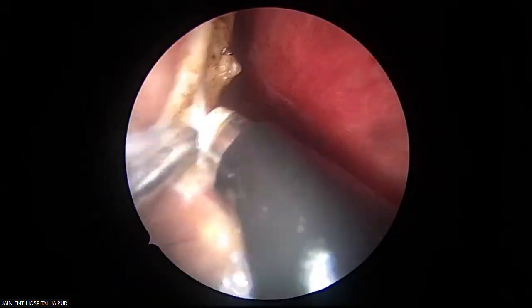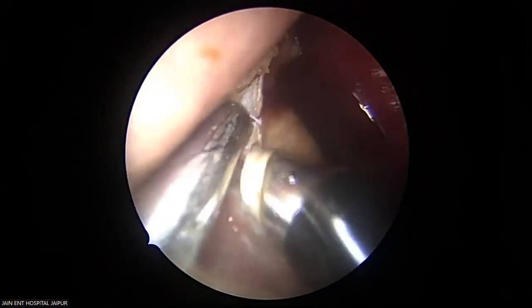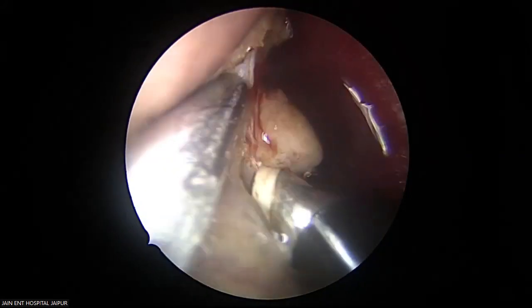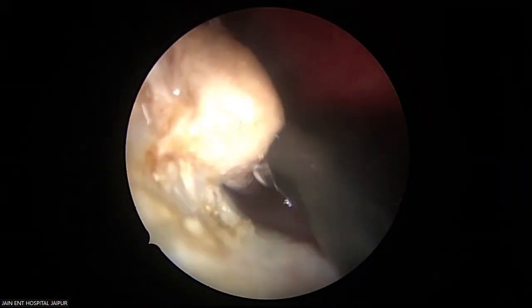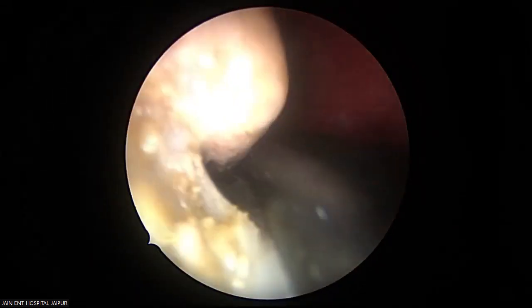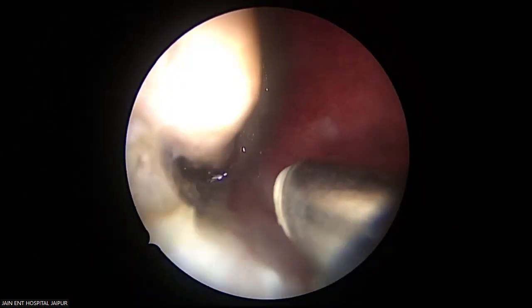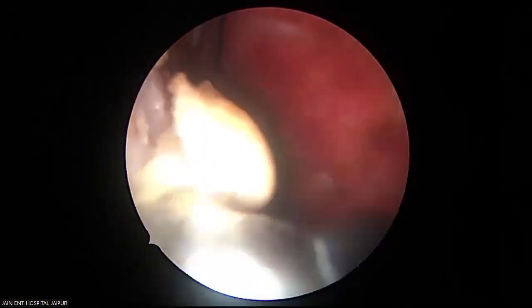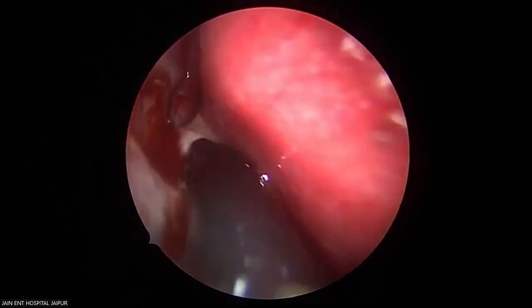Okay. This is my anterior limit. See the piriform aperture? This is the bone of the piriform aperture. Inferiorly, this limit is the floor of the nasal cavity. See this floor? Then this is the inferior turbinate, which has to go accordingly.